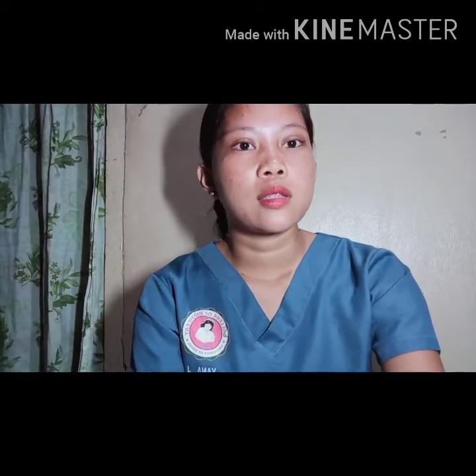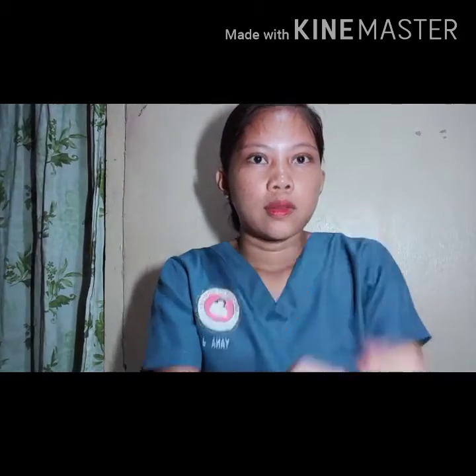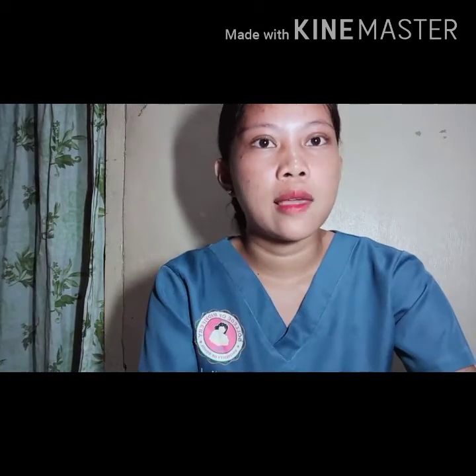Is remove IV solution from outer packaging and gently squeeze. So after ka gather sa supply, remove nimo ang IV kanang package sa IV solution. Tear the perforated corner of the outer packaging. Check color, clarity, and expiration date. So sa ginaingon na ako ganina nga tanang equipment, i-check nimo ang iyang color, clarity, and most especially the expiration date.